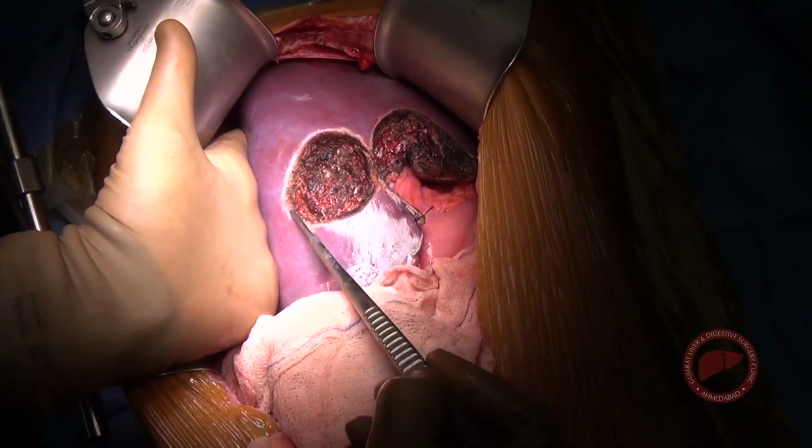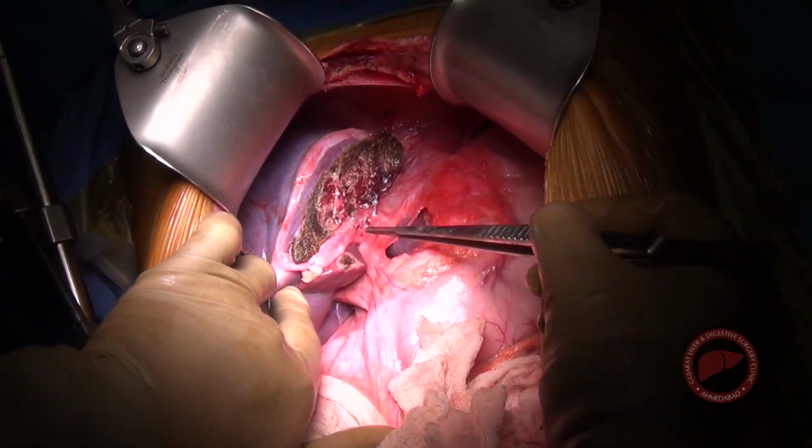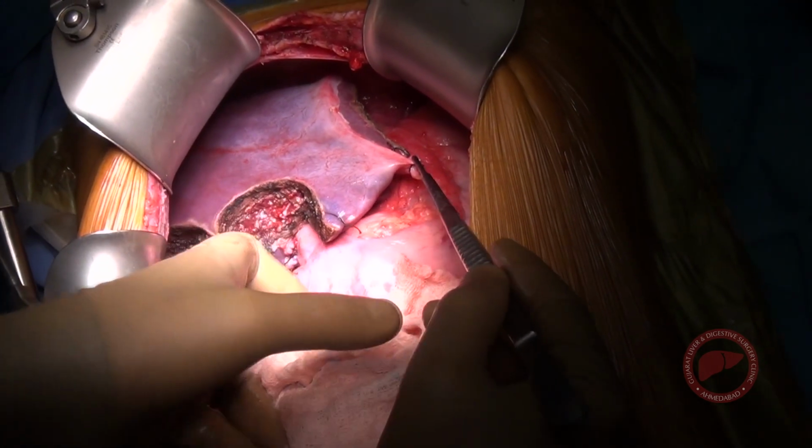So that is the final picture. You can see 2 metastasectomies on the right side and that is the left lateral segmentectomy for segment 2-3 liver metastasis.